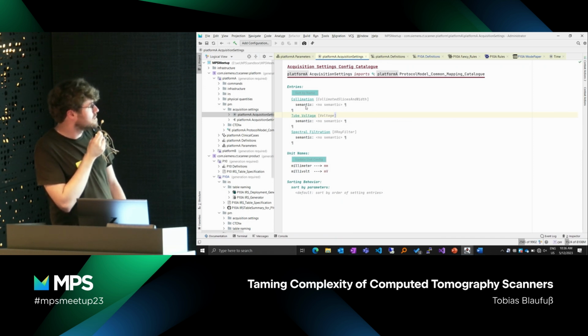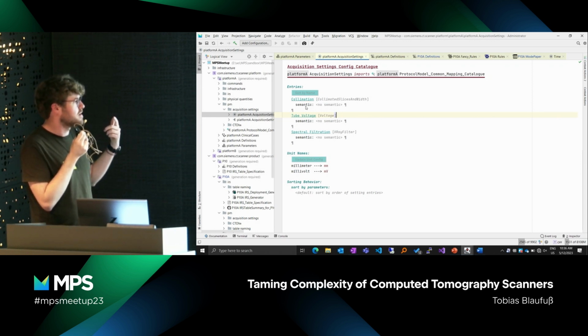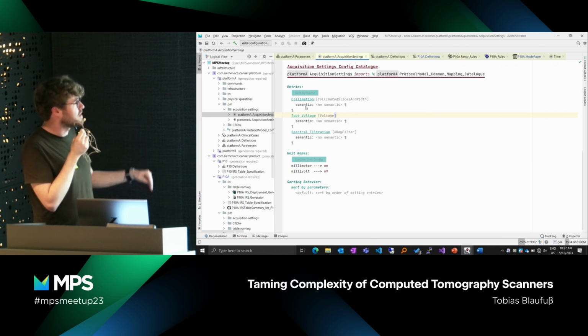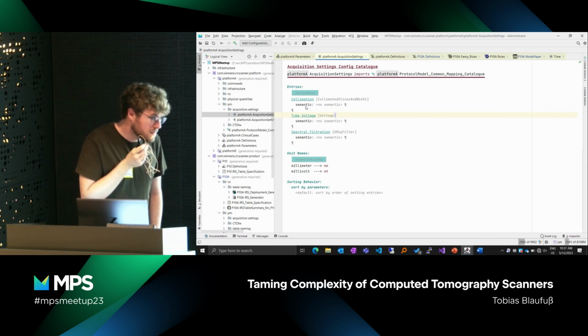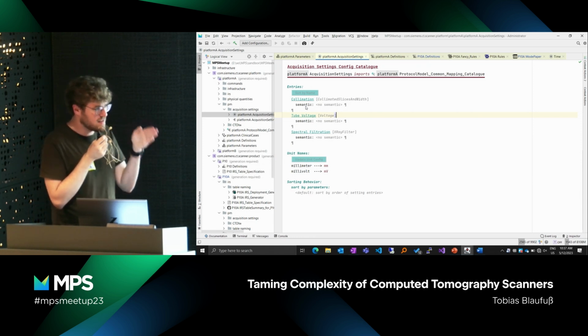Yes. So what I didn't tell, there could also be another hierarchy above these platforms, because in our case, parameters should be known to platform A and platform B, but values and default values could differ between those. And then on the top level, you can define rules based on semantics. Yeah, but there are ifs in the code area for this. Yeah, exactly. If a parameter has a semantic, it has to have exactly this name, and it can't be changed.